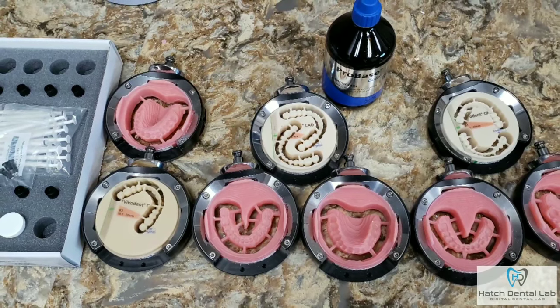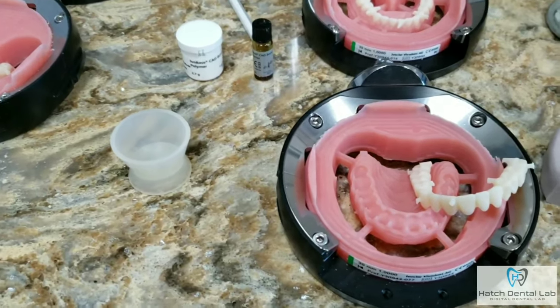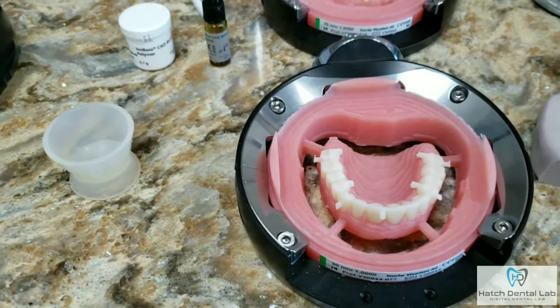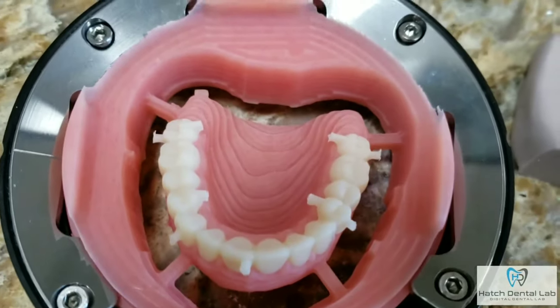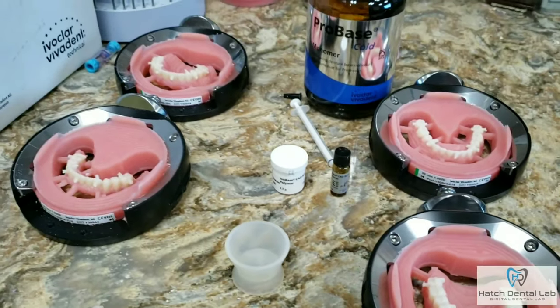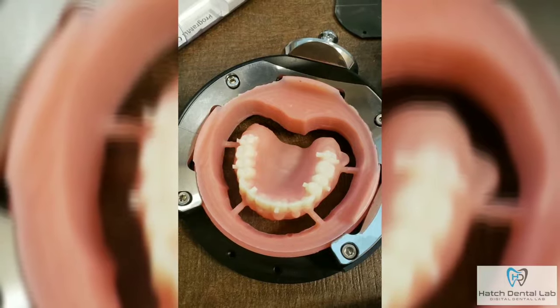The fit of the teeth into the sockets is amazing. As you can see, there's no pressure put on these teeth — it is completely passive. This shows how accurate the process is. We use IvoBase CAD Bond Kit because we want our dentures to be eight times stronger than analog dentures. You will not find our lab using cheap home remedies to save money. It is all done by the book so it can deliver every time.